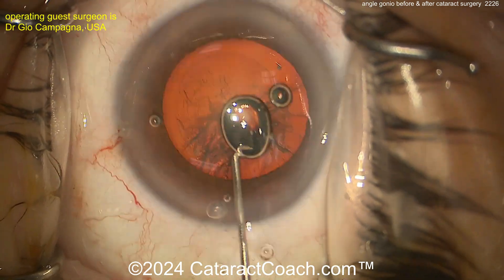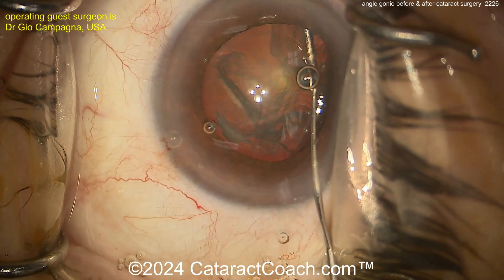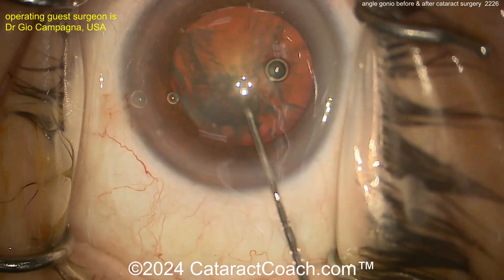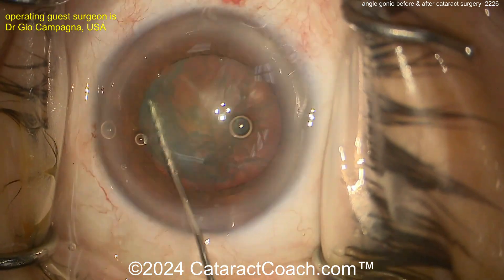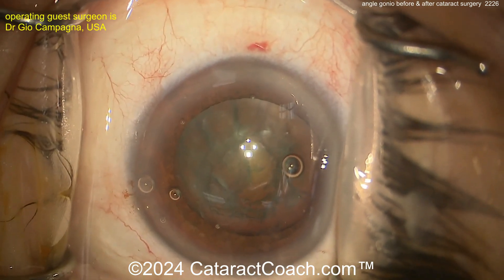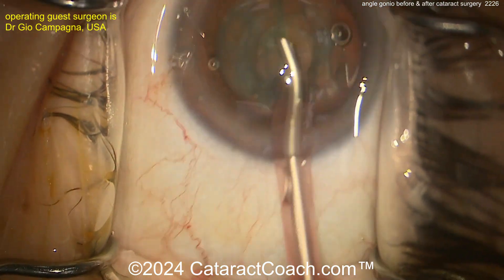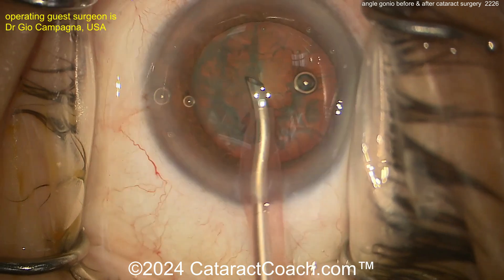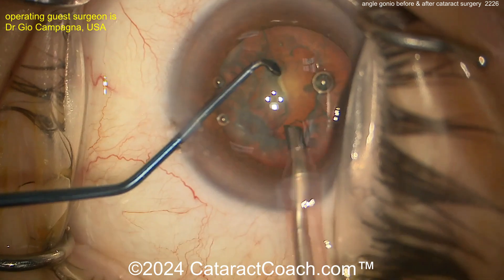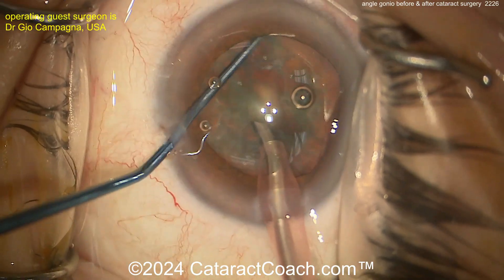Here's some hydrodissection. In a case like this, I would not want to prolapse the nucleus out of the capsule bag — you want to keep this in the bag because you have a very shallow anterior chamber. Easy to do your nucleofractis, whether it's phaco chop or stop-and-chop, in the capsule bag. Good hydrodissection there. A little extra aliquot of viscoelastic. Phaco probe going in, bevel up. And here comes a chopper — looks like a paddle chopper, maybe a combo chop. Good-looking chopper right there in the bag.